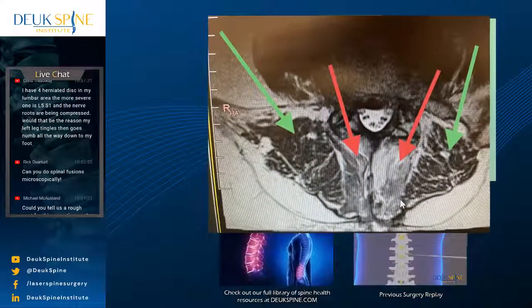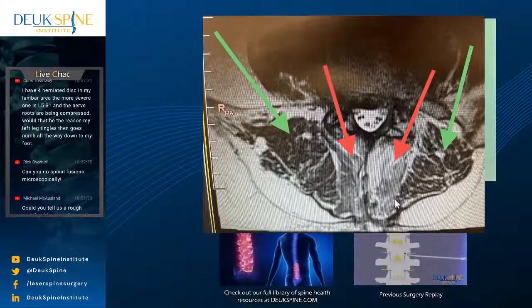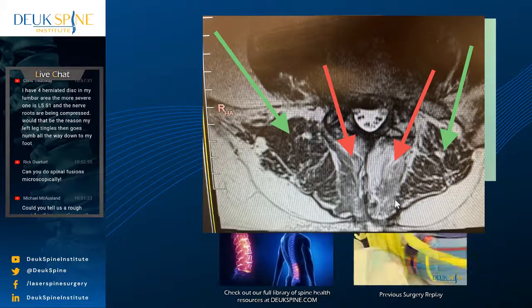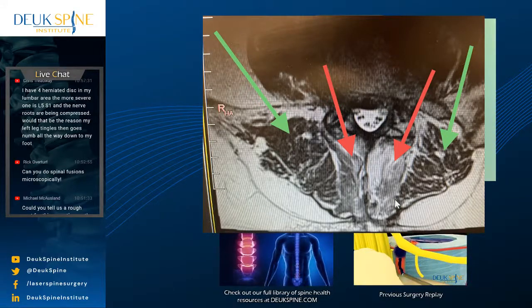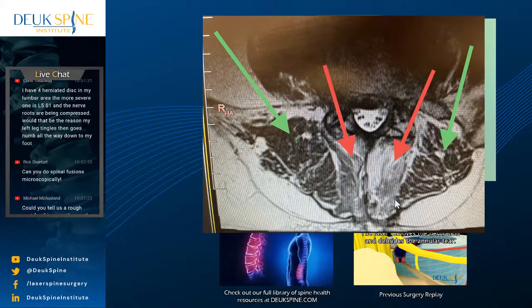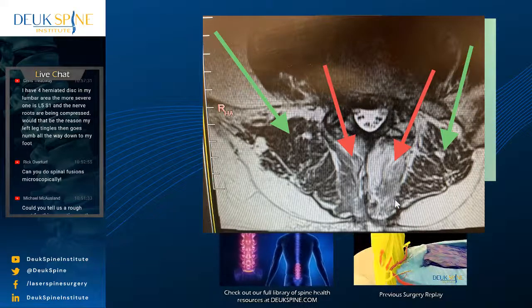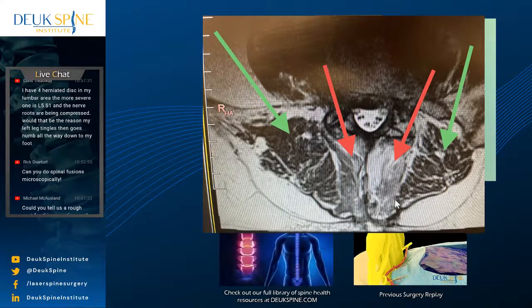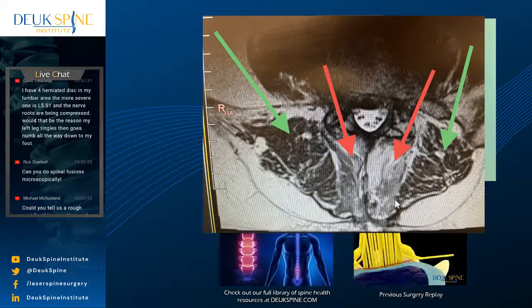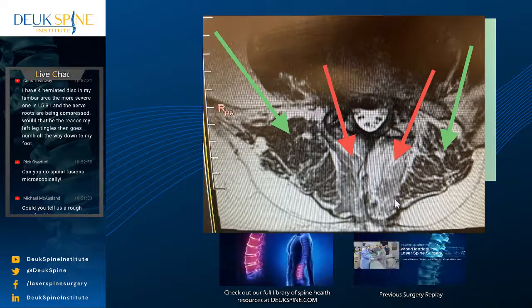All right, the picture we have in the bottom corner, I just want to draw your attention to it. This picture is an MRI of the lumbar spine, and the arrows are pointing to these colored zones. If you look at the red arrows, there's a lot of whitish color. That was a muscle, and now it's mostly scar tissue. This patient had a laminectomy done, not by me, but by somebody else. We get a lot of people that come here that have had surgery elsewhere, and they're still in pain, and they want me to fix them, and I can fix them.